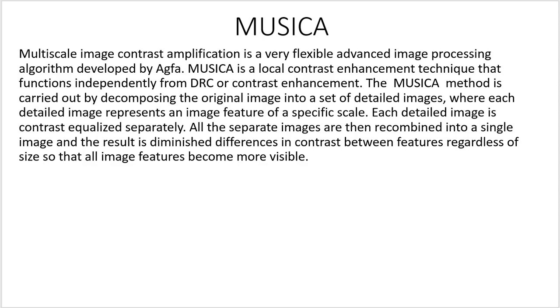The Musica method is carried out by decomposing the original image into a set of detailed images where each detailed image represents an image feature of a specific scale. Each detailed image is contrast equalized separately, and all the separate images are then recombined into a single image, and the result is diminished differences in contrast between features regardless of size, so that all image features become more visible.